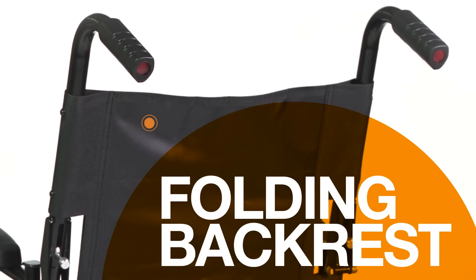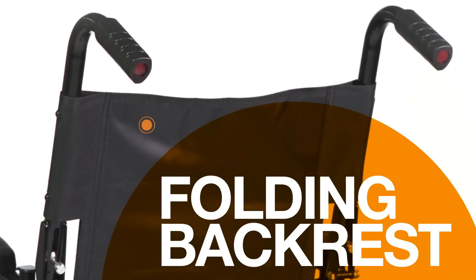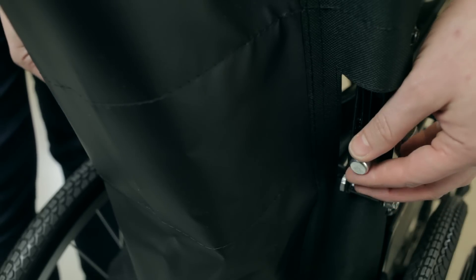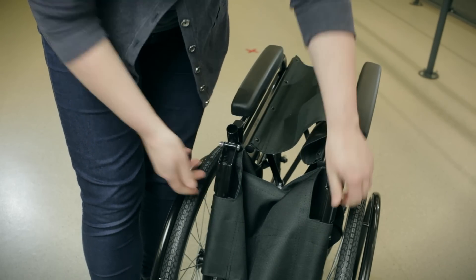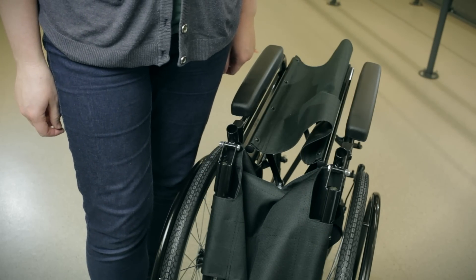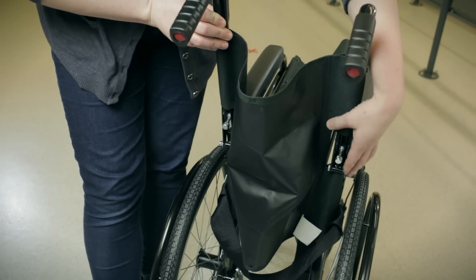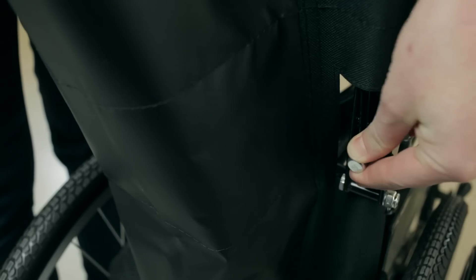Most wheelchairs have a folding backrest, making it smaller for travelling or storage. Hinged backrests usually have two levers that are lifted at each side of the frame. When they're fully up, the backrest can fold at the hinge. To raise the backrest, simply lift until it's upright and check that the levers are fully into the locked position.